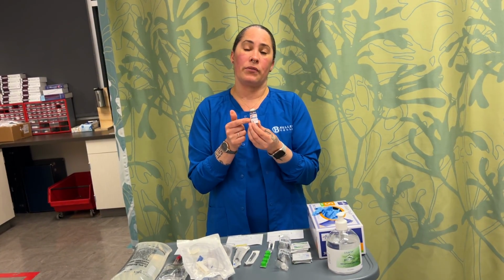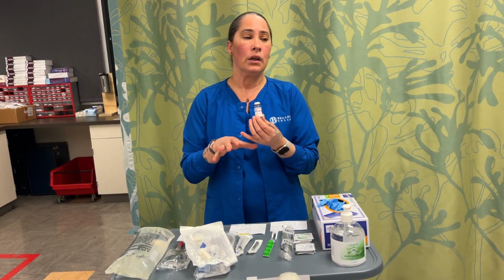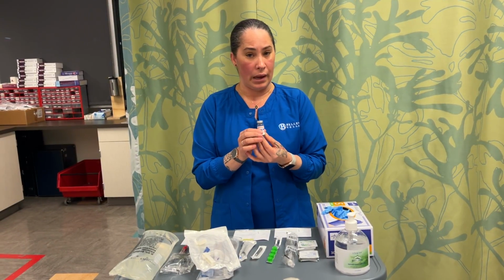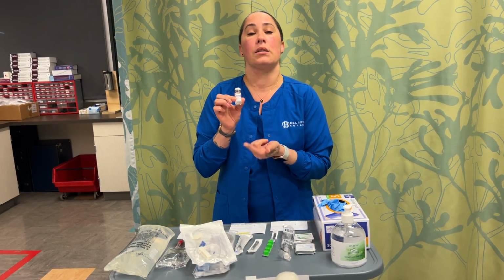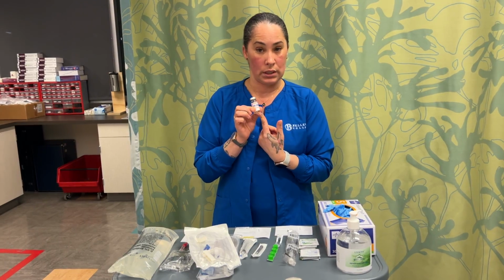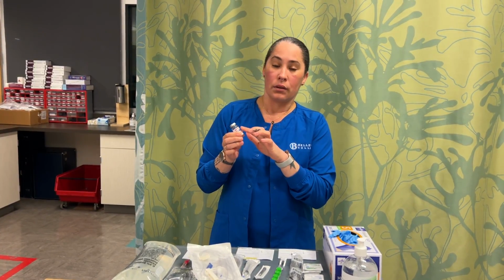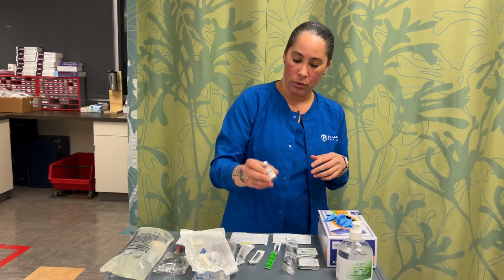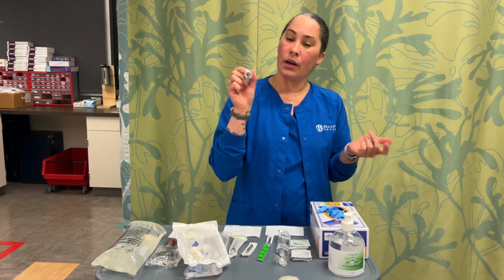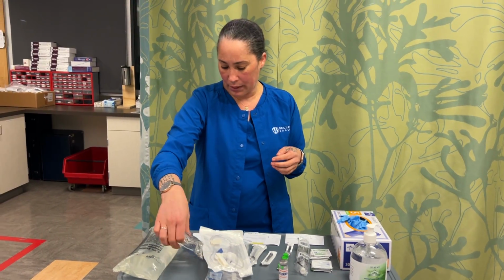So when you grab the vial, you're going to want to make sure, even with all this other stuff, that everything is up to date and nothing's expired. And you're going to want to make sure that when you grab this vial, it is the medication that you're supposed to have. A lot of meds have similar wording and names, and so you have to be very careful. So we have our Zofran, our ondansetron, and this piggyback medication.